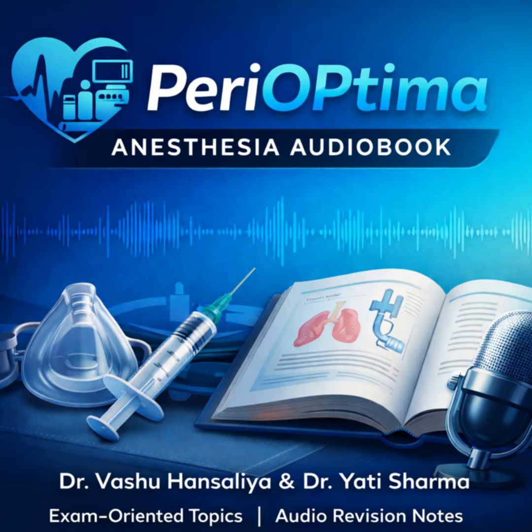And AI. Is the robot coming for our jobs? Not yet. Miller touches on this. AI is currently helping with image acquisition and interpretation. It can auto-label the anatomy on the screen for you or auto-count the B lines in a lung scan. It's an assistant, a co-pilot, not a replacement. It helps the novice get a better picture faster.